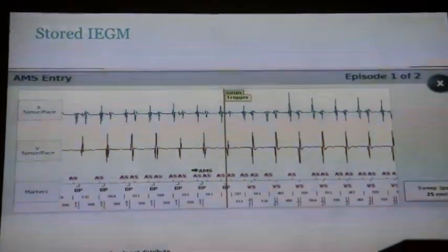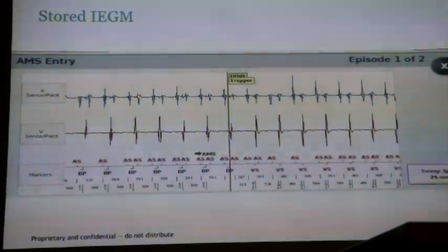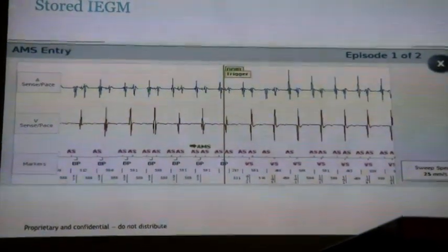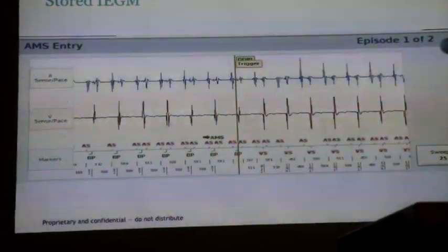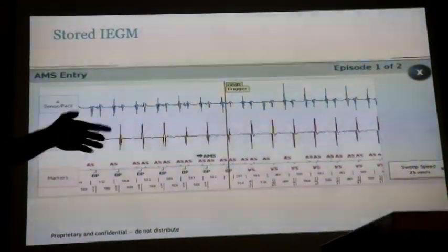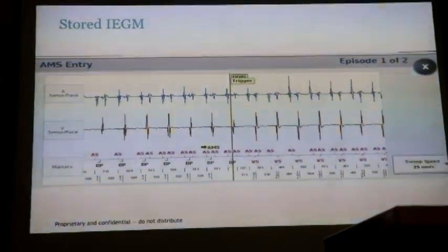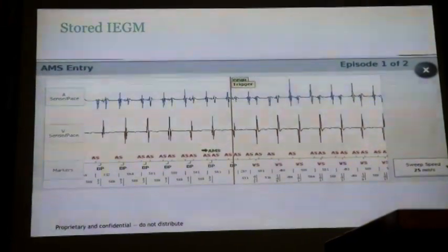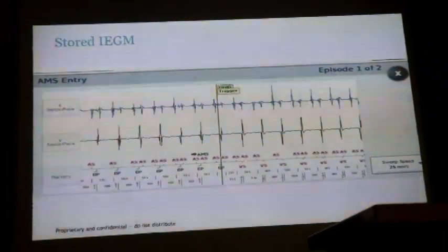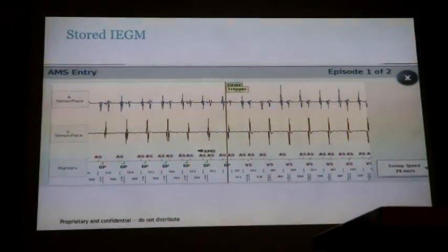So what are we going to change? Atrial sensitivity? We could, but here's a far field, look at the size of these far fields. They're nearly the same size. I would want to know where this atrial lead is. Has it gone really low? But the threshold's fine, so it probably hasn't moved. The only function you can change here is the postventricular atrial blanking, PVAB. From the R wave to here, we extend that out a little bit.